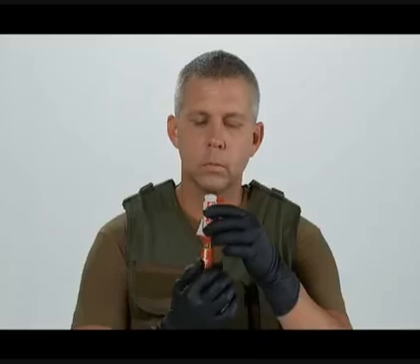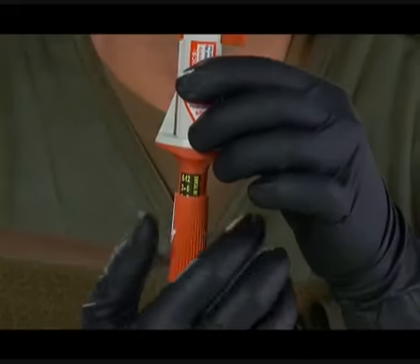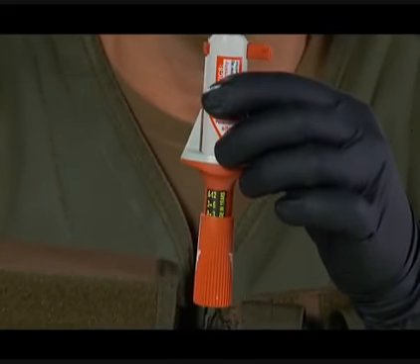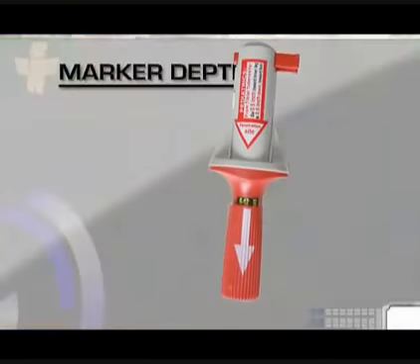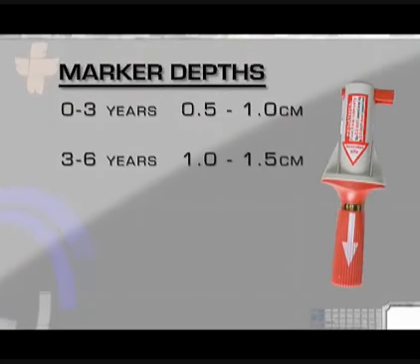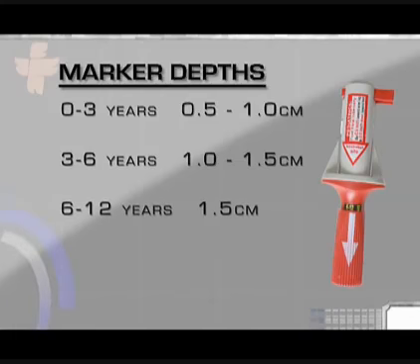Now, using the red barrel, adjust the BIG's penetration depth according to the patient's age. The age and length are both marked on the device. The markers are 0 to 3 years, 0.5 to 1 centimeter. 3 to 6 years, 1 to 1.5 centimeters. 6 to 12 years, 1.5 centimeters.